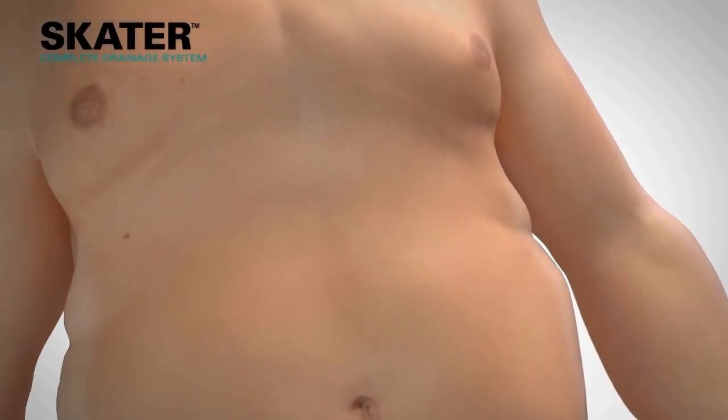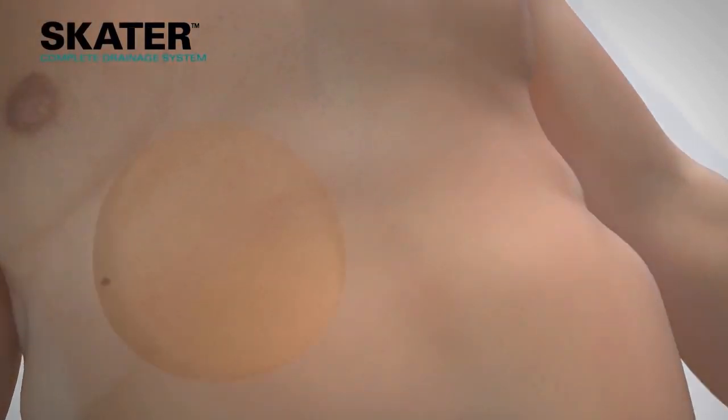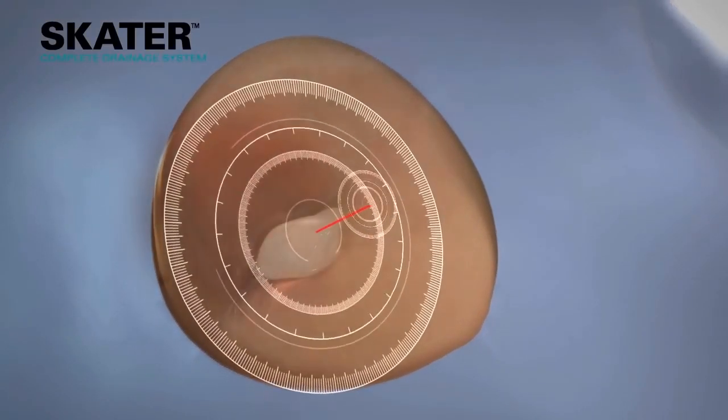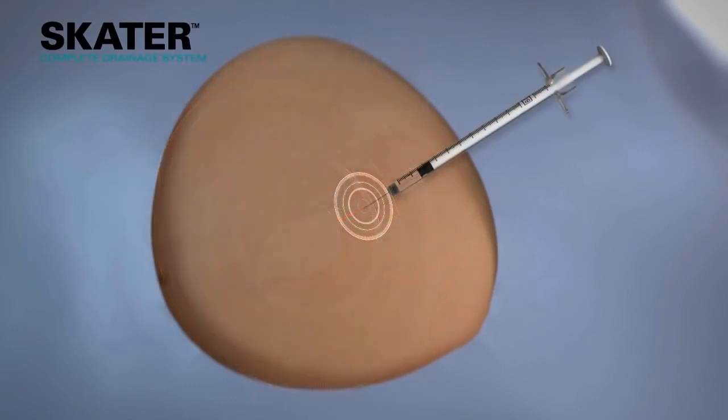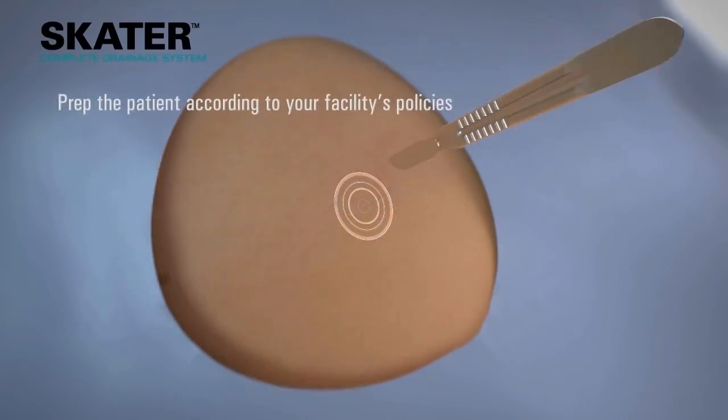The SCATER catheter placement procedure for abscess drainage is conducted under imaging via either the direct stick or over the wire method. Once the pocket of fluid has been targeted under imaging, local anesthesia is applied and a skin nick is created to insert the drainage catheter.